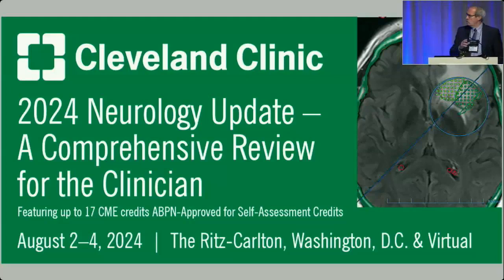Laplacian montage. So no, we did not discuss the Laplacian montage. A Laplacian montage is when you take the referential electrode, and you use the local electrodes around it, sum them, and it provides more of a localized version of a common average montage.